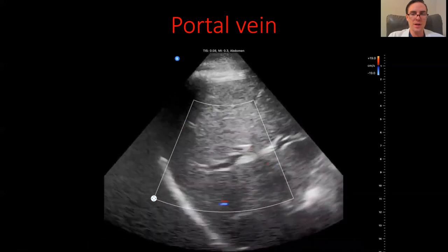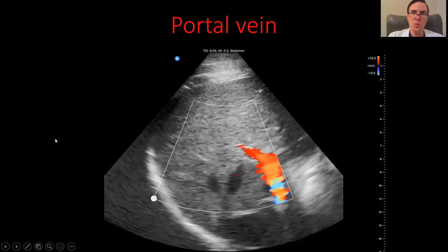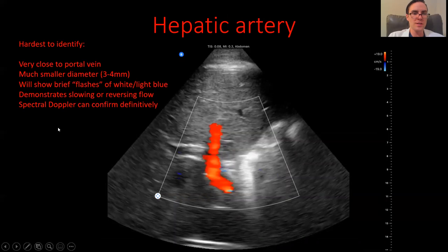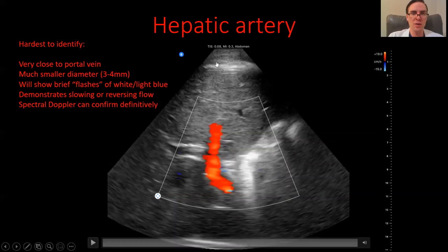If the portal vein is showing flow going in the wrong direction, or if it's sluggish, that can be indicative of portal hypertension — an important pathological finding to recognize. Now the hardest vessel to identify is probably the hepatic artery because it works very differently from the veins. It's much smaller — its diameter is maybe three to four millimeters, whereas the portal vein is one to two centimeters.